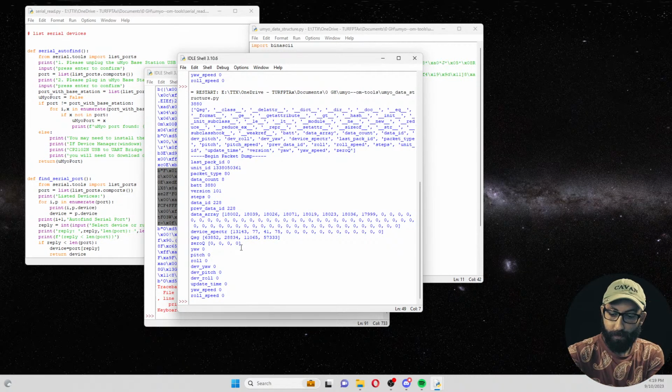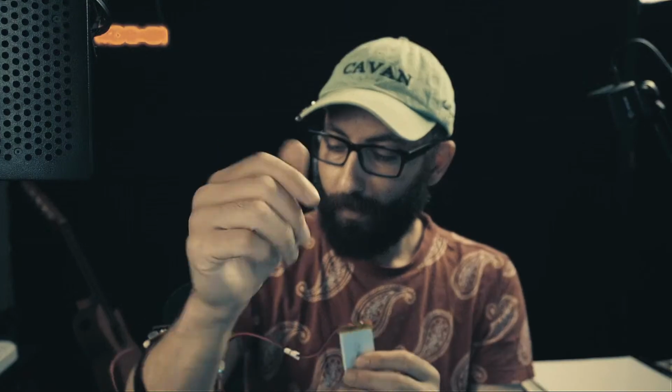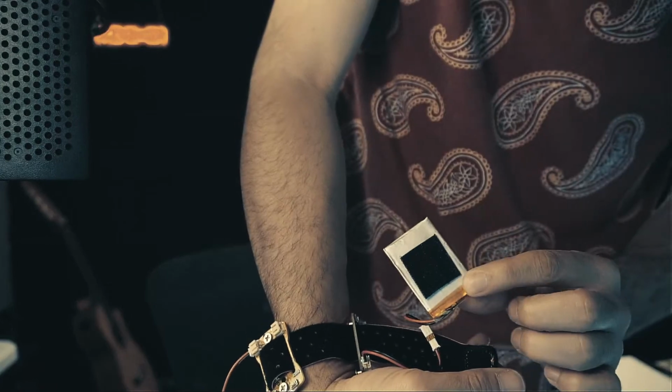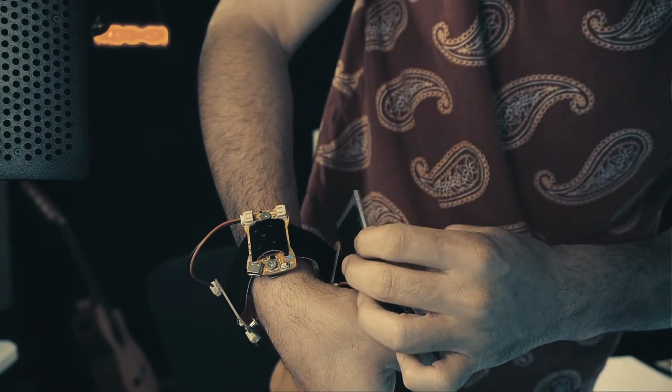So I've placed, what's really cool about this bracelet is this bracelet works super well. So when you kind of fold it over, even for multiple ones, I actually turned the bracelet inside out. And when you do that, what's kind of nice is depending on how big your forearm is, you can use where it folds over on itself as a spot to put the battery. So it's really, I don't know if you guys can see this. So I'm using the static Velcro on the opposite side of the battery to just kind of be sat here in the middle. Sorry again for the camera angle.